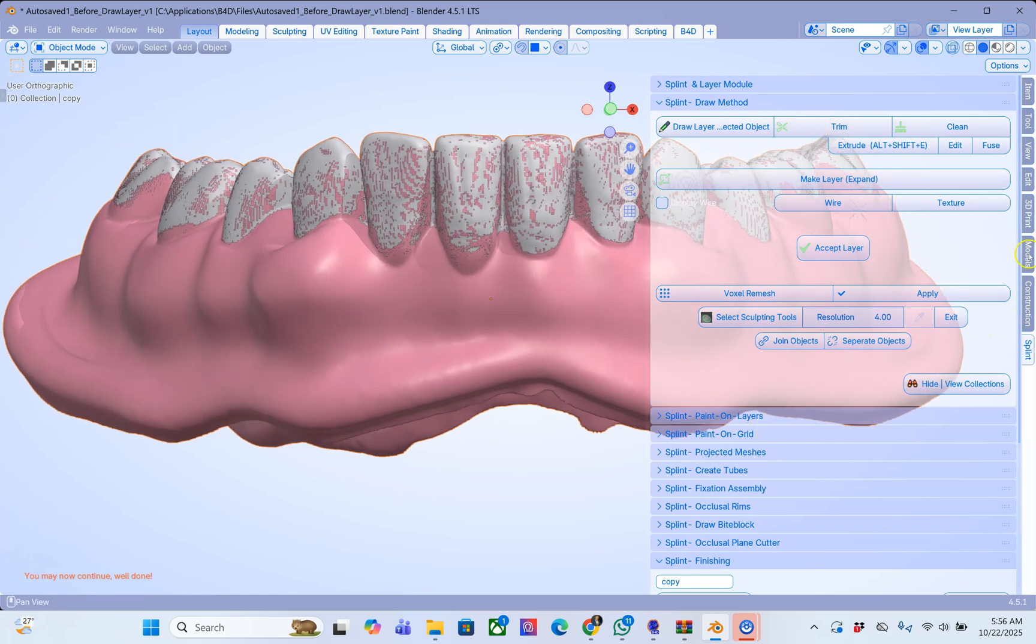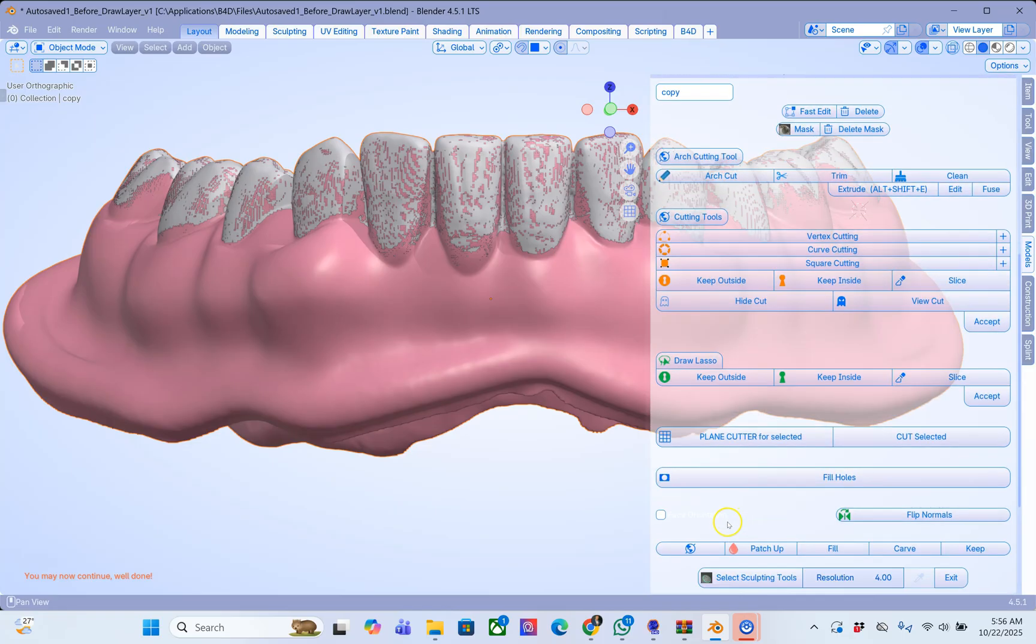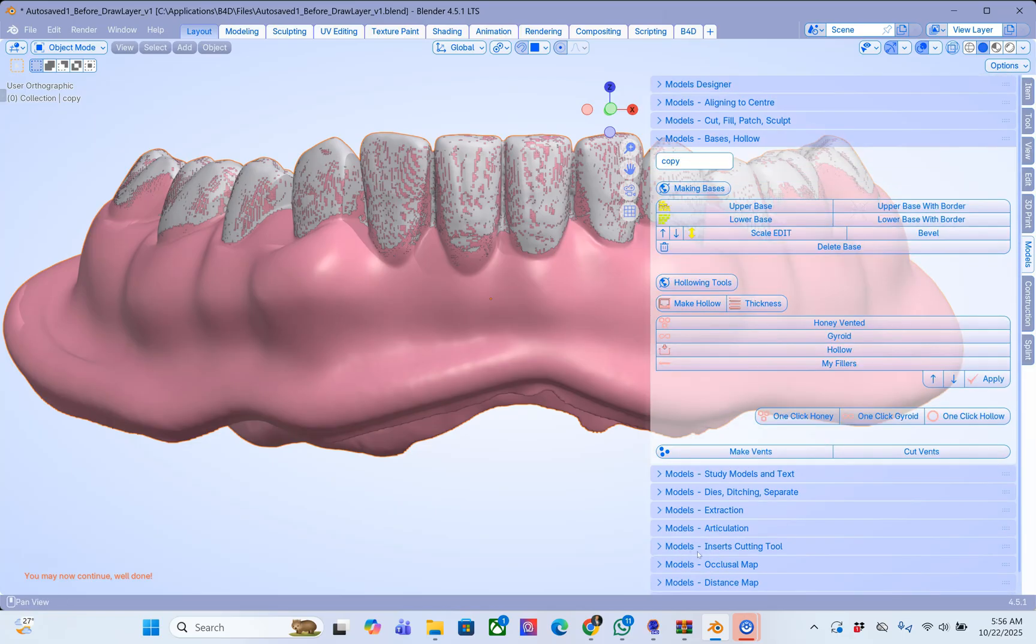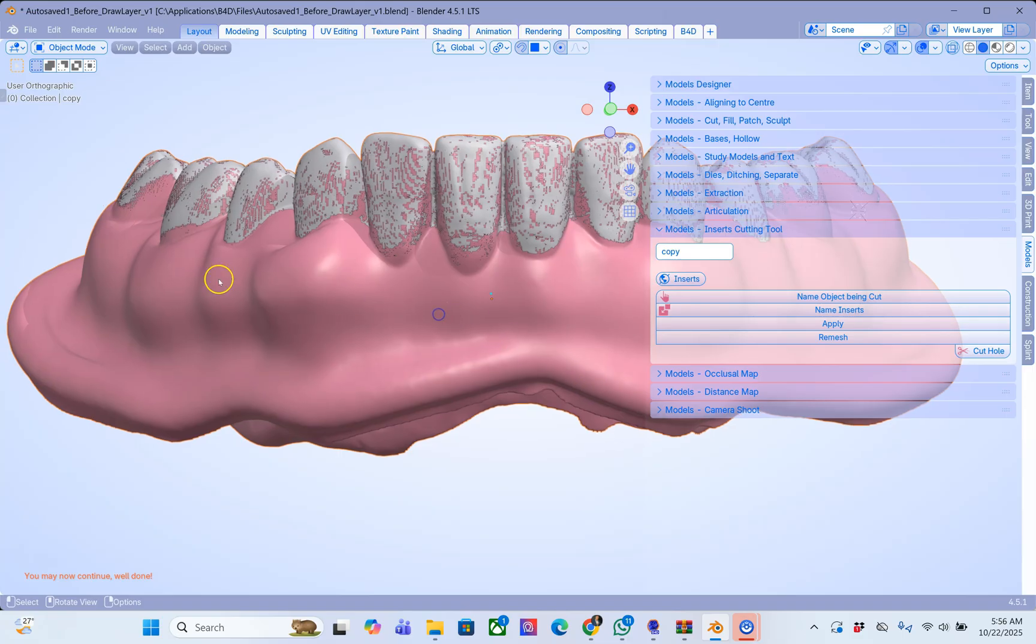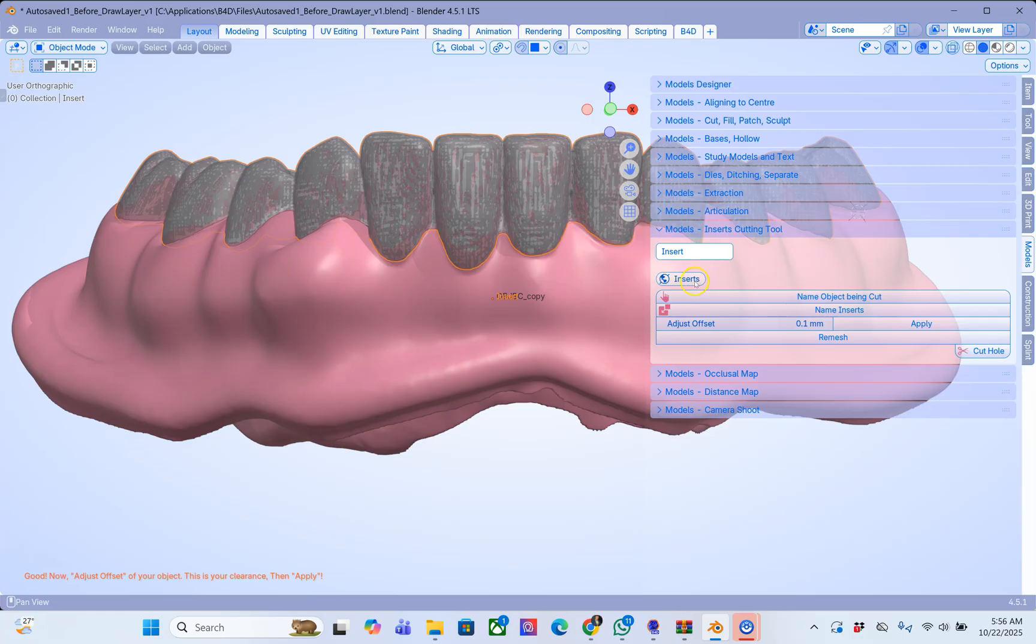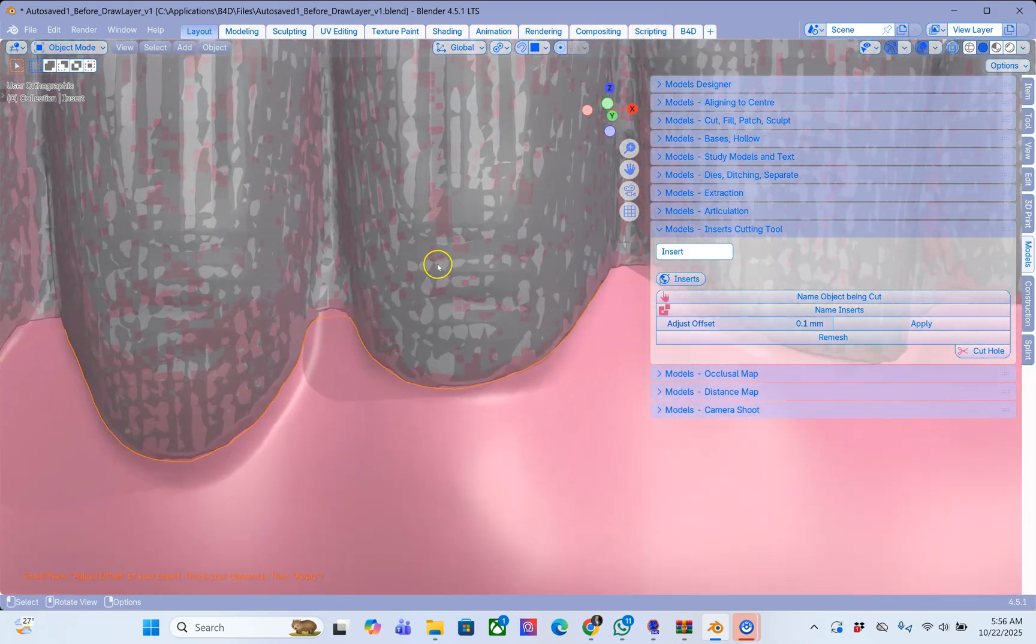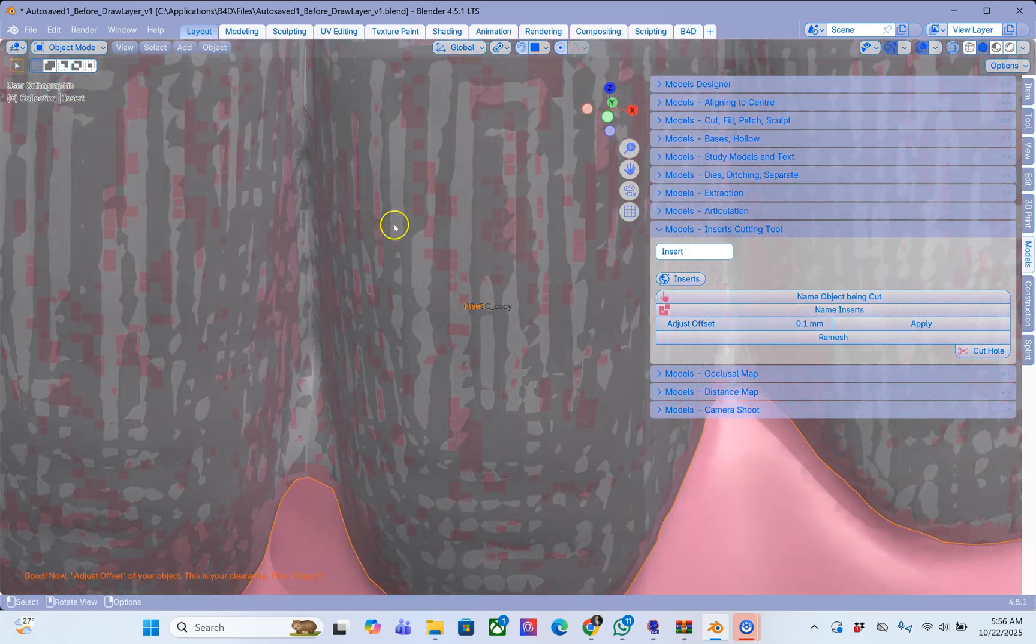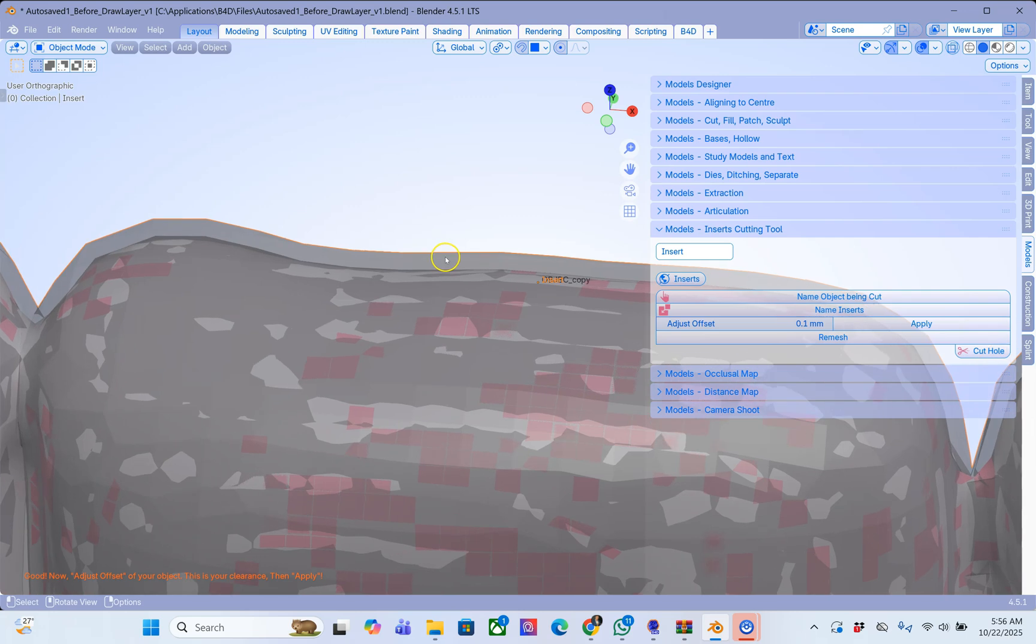Go to the model designer. At the bottom there is a menu called the insert cutting tool. Now this is becoming our object being cut and this is going to be our insert. Now this menu is quite important because it creates an offset. Adjust offset depending on how much space you want to be in between these two parts.